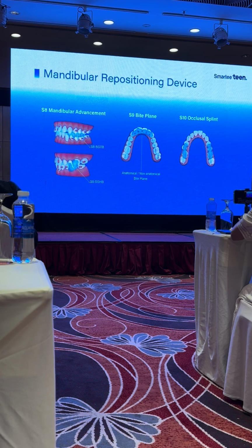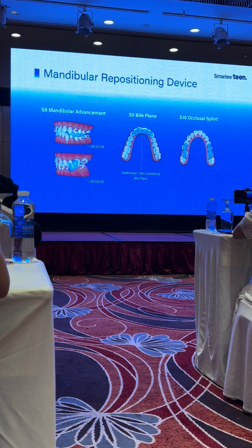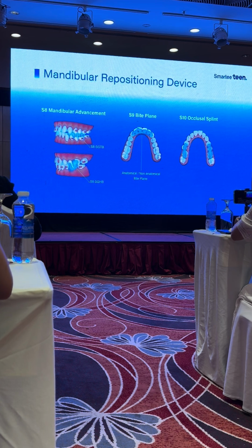This is S9, and then we come to S10. S10 may be quite similar to the SGTB, but with S10 we do not have blocks at the lower arch.